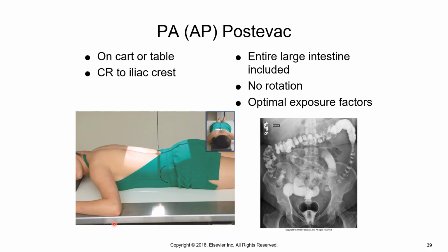The exposure is on expiration, and ideally what you're seeing on this is far less barium in the large intestine than the AP image that you took at the beginning of the exam. So I can't flip back in the PowerPoint, but if you flip back and look at page 527, the amount of barium that you see in that radiograph compared to the amount of barium in this radiograph, it is much less.